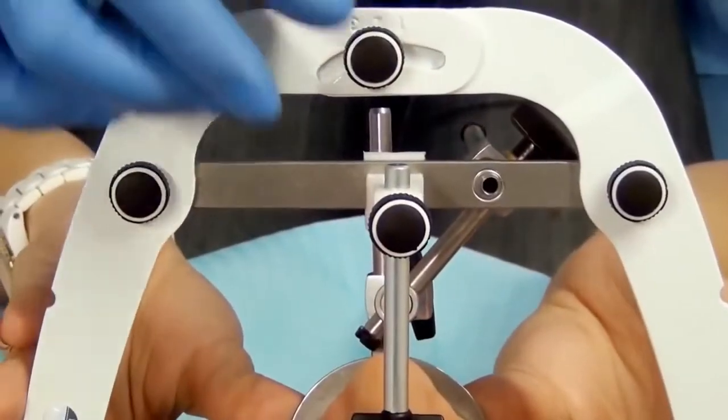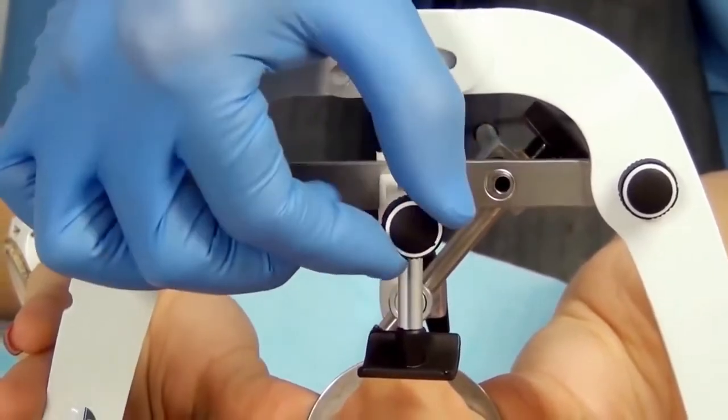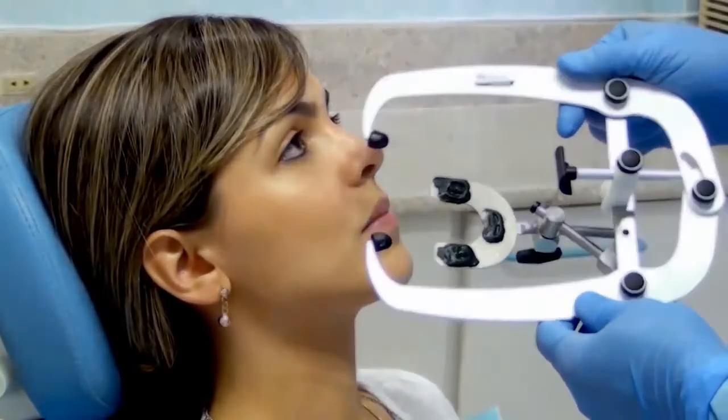To remove the face bow, loosen the screw of the nasion relator and the central screw of the face bow. Remove the entire set carefully. Preparation of the A7 Plus articulator.